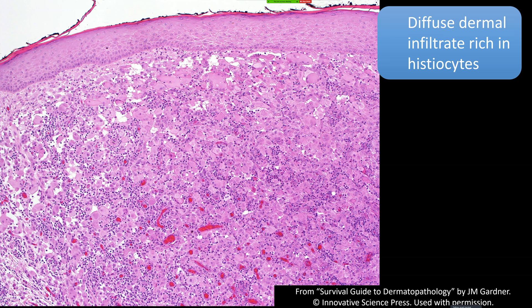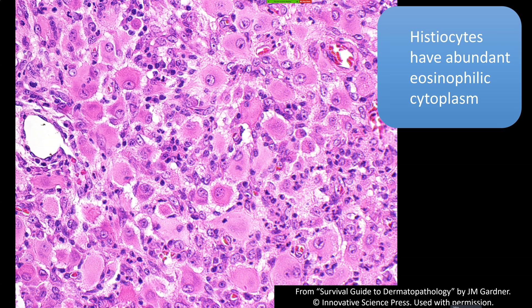They also tend to have some background inflammatory cells including eosinophils. Sometimes they can have foamy cells and Touton giant cells, so even though I think they're probably two separate things etiologically, microscopically they really have a spectrum of morphologic features that overlap.